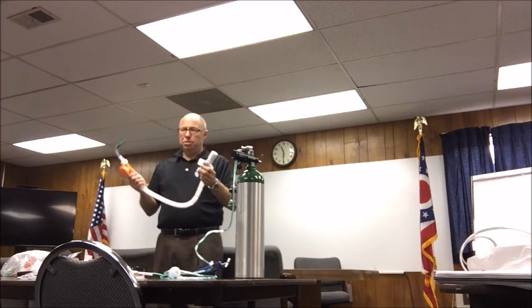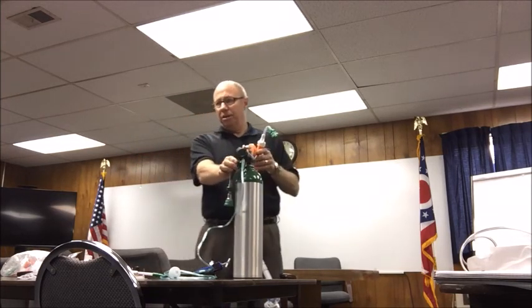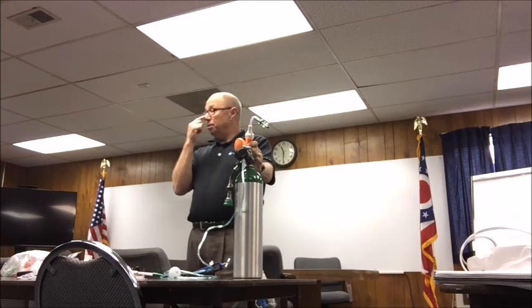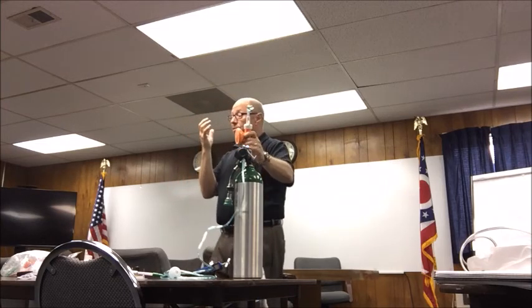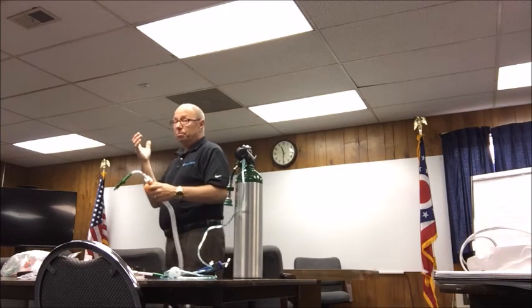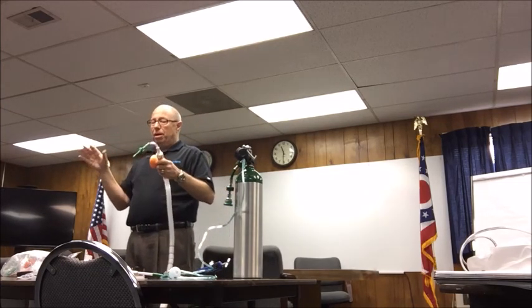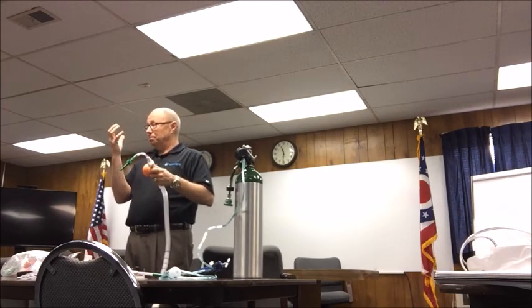Any questions about CPAP? The keys are high pressure. You've got to use a high pressure, which you're all used to. Sizing the mask: reading glass level instead of eyeglass level. Not a lot of pressure on the mask. If it leaks, loosen it. That's just crazy to think about. If you're getting leaks in that mask, loosen the mask.